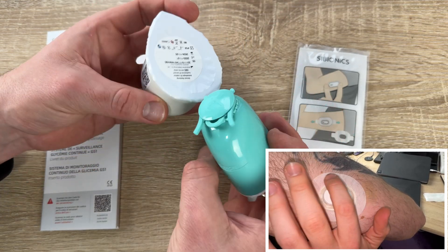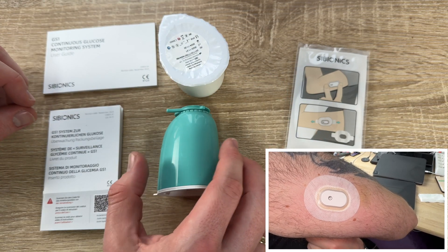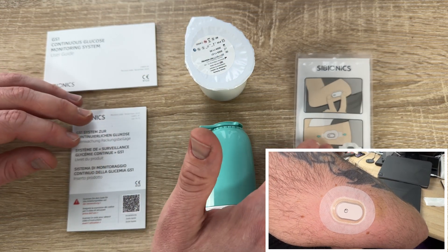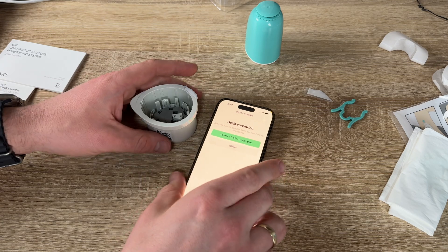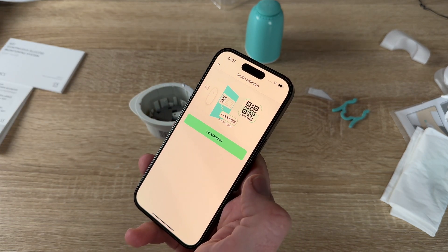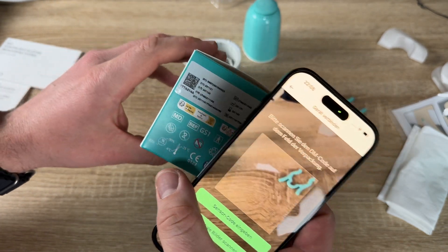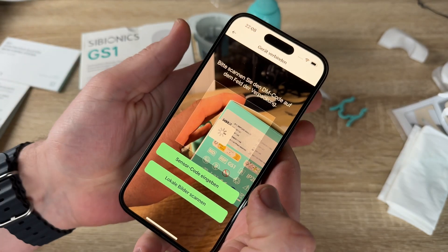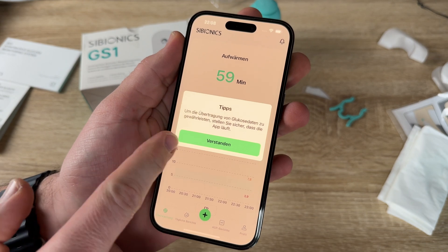The patented over-patch ensures long run time with scan-free continuous monitoring. The GS1 CGM's robust Bluetooth connection ensures uninterrupted data streaming, delivering updates every five minutes — a total of 288 times a day. With its IPX8 rating, the GS1 CGM doesn't just withstand water — it thrives in it. No need to remove it during water-related activities; it can even be submerged in 3.3 feet of water for up to one hour.